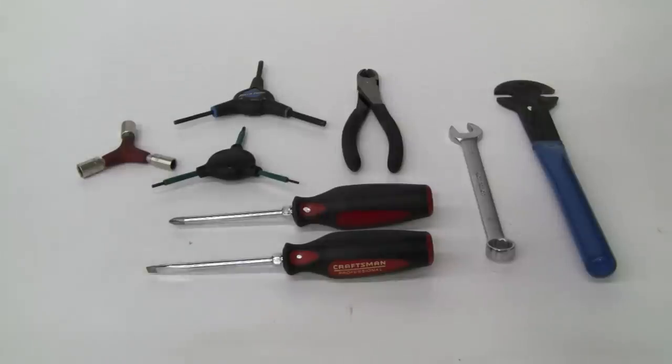Required tools. Tools for assembly have been provided with the scooter; however, we recommend that you use mechanics-grade tools.